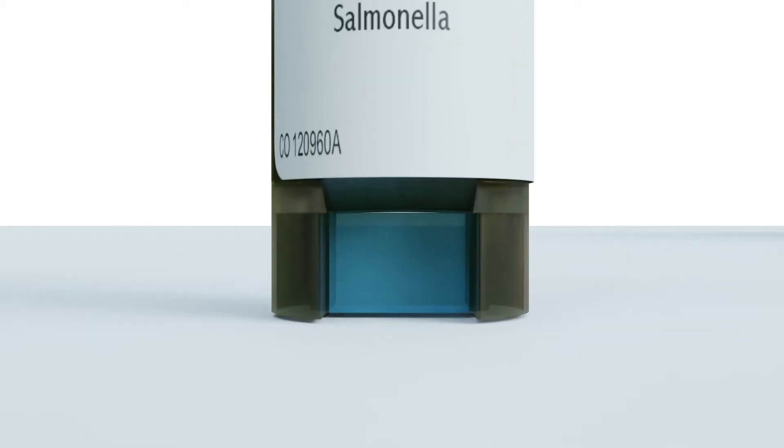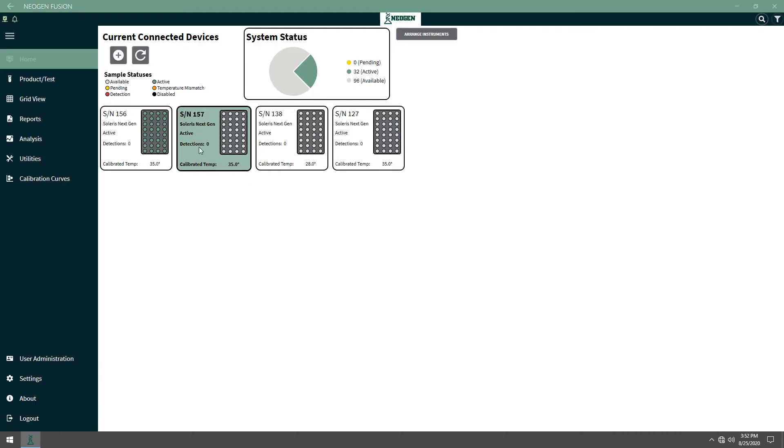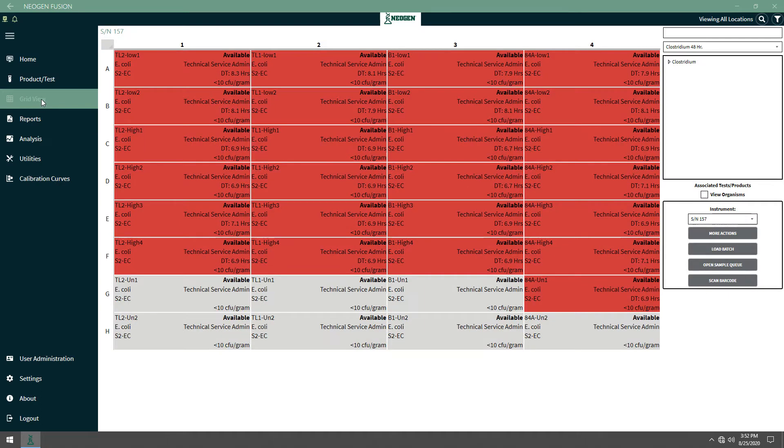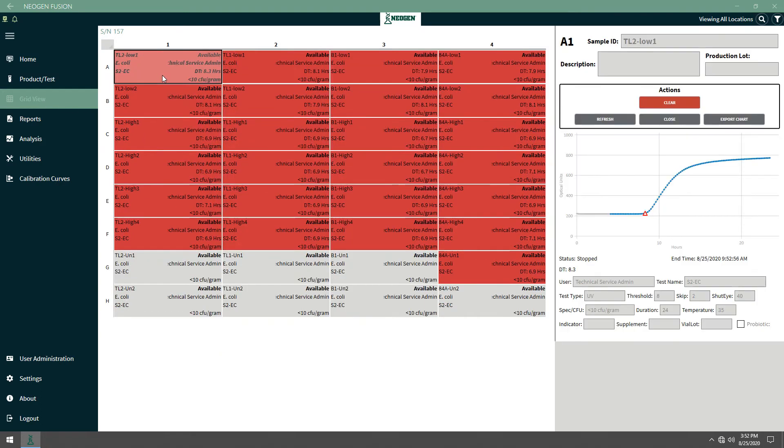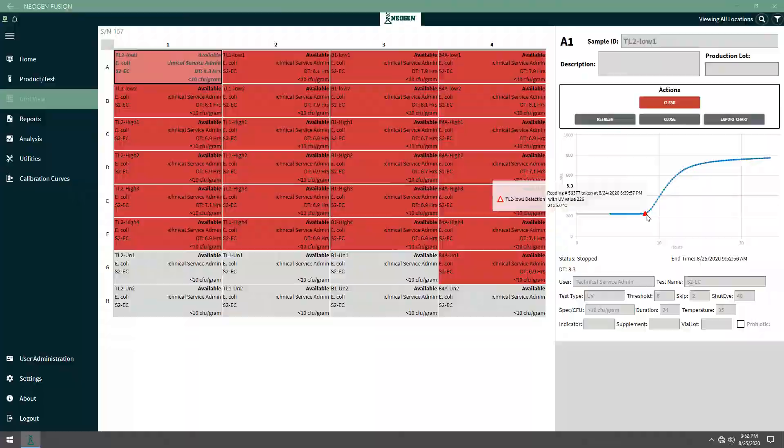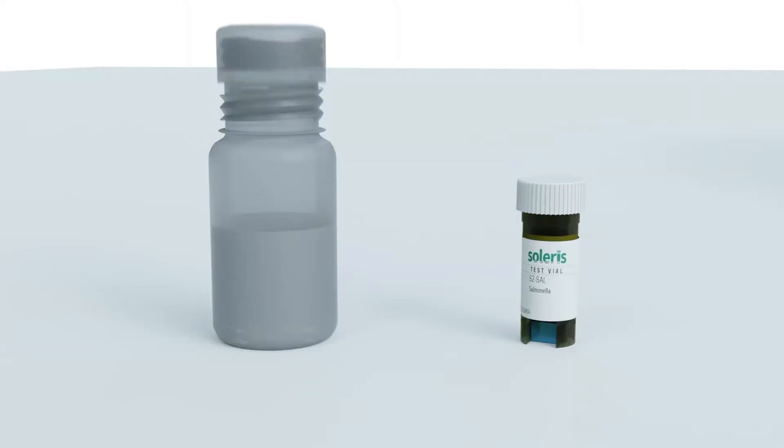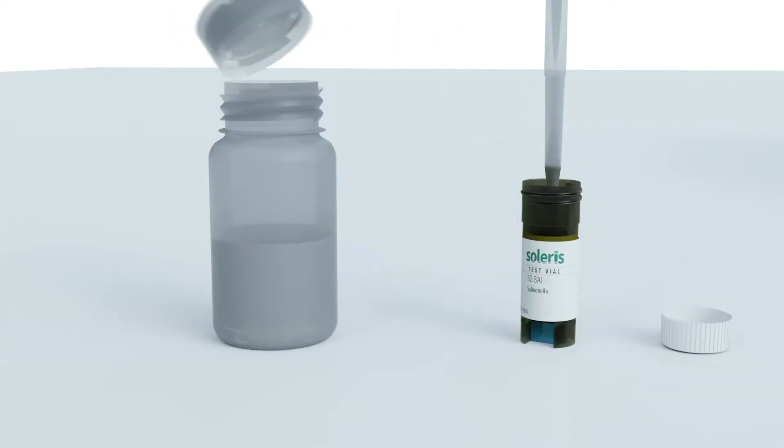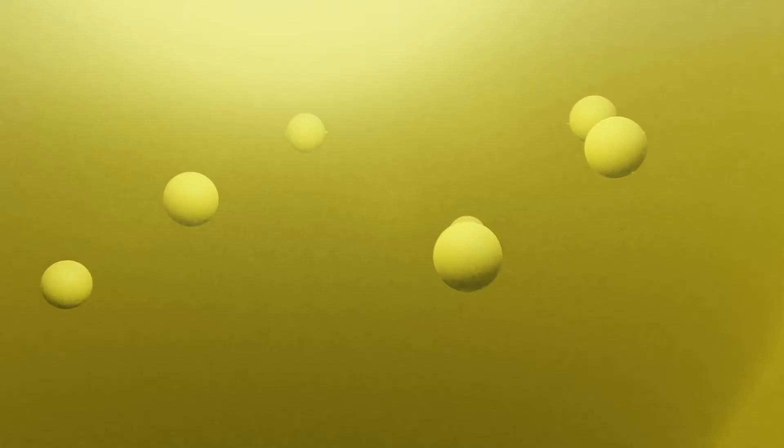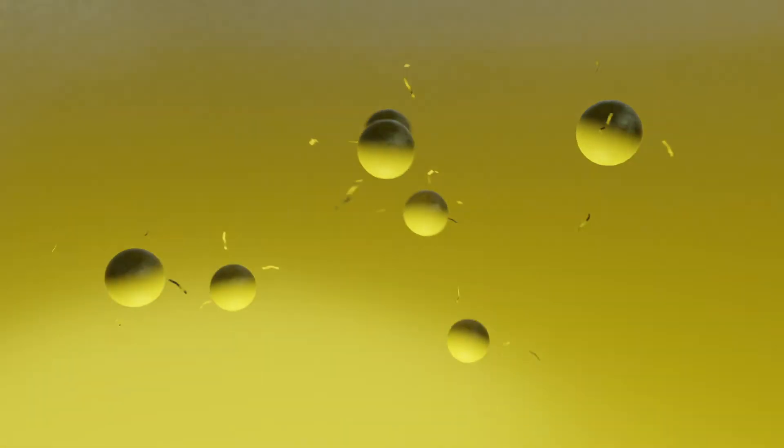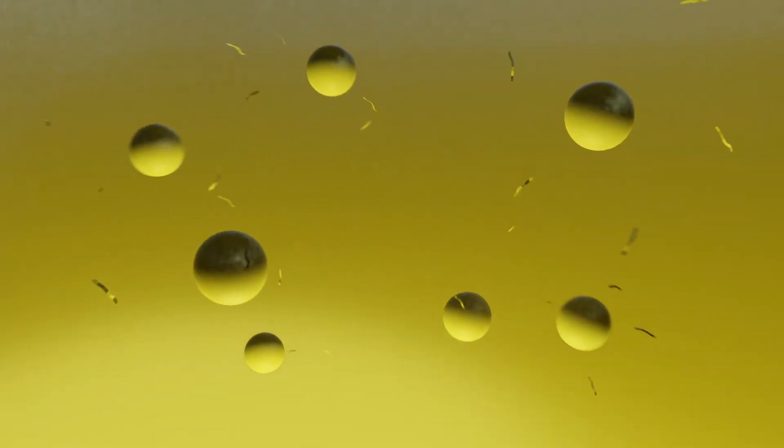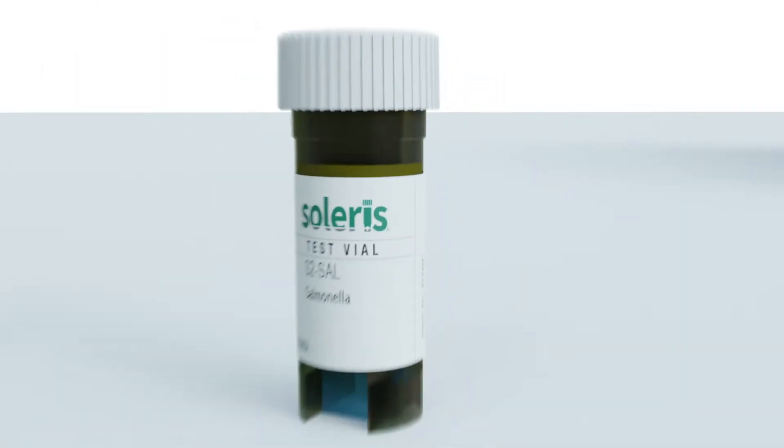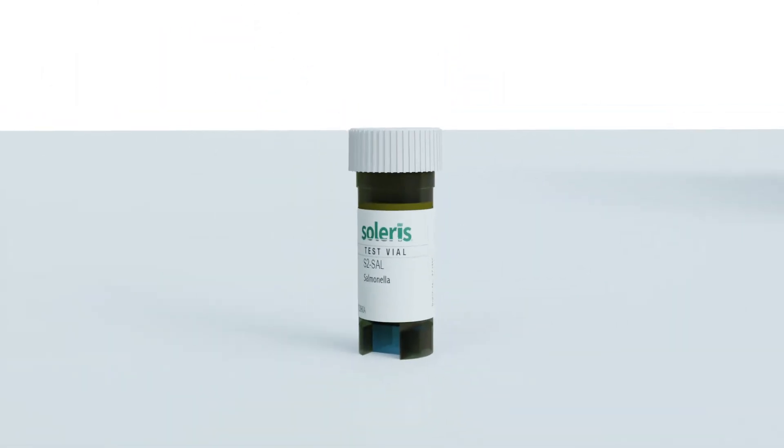The Solaris Windows-based software package securely interprets, displays, and then stores results. The CO2 producing organisms in the added sample metabolize the nutrients in the broth. This allows Solaris to detect the organisms.